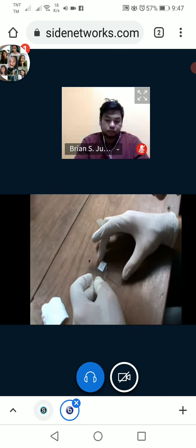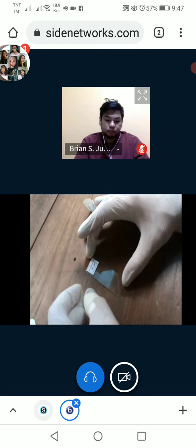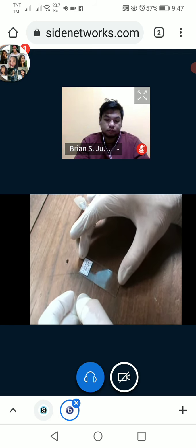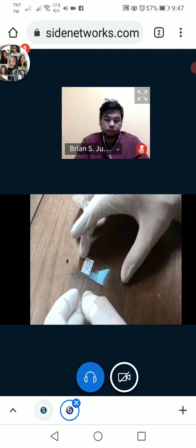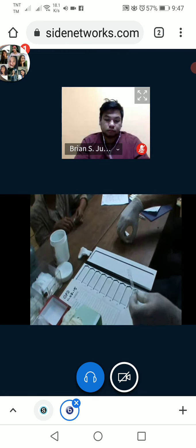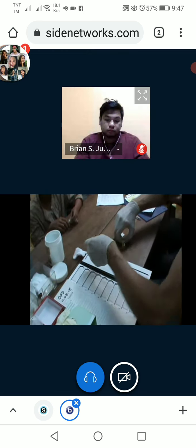With the corner of the spreader, join the 2 or 3 drops for the thick blood film with a few circular movements in order to obtain a circle of about 12 mm in diameter. Place the slide in a slide folder to protect it from dust and flies. Leave it there until blood has completely dried. The folder should be on a flat and level position.